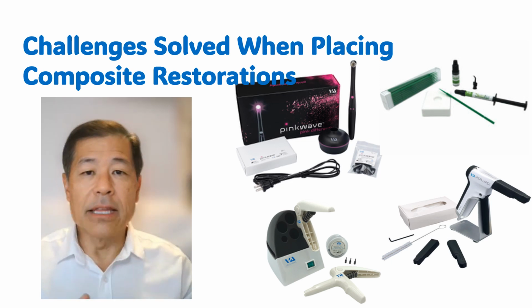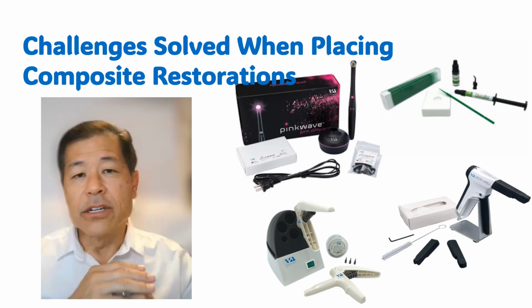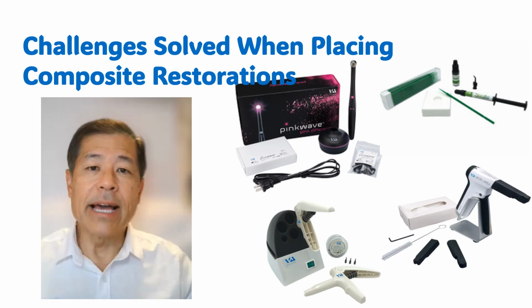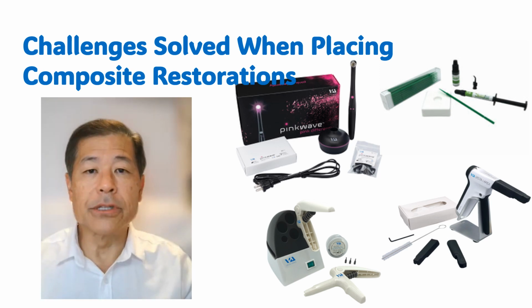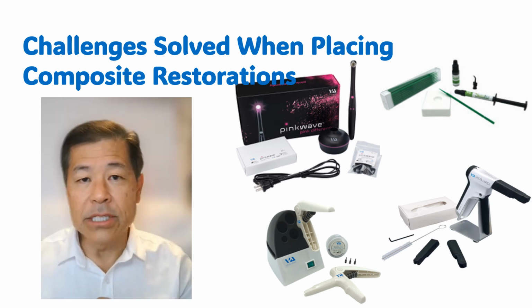Voco has a very highly filled composite, and when you squeeze that out of the composite dispensing gun, it's very thick, and to spread it is very difficult. But it has a lot of the great physical properties you want in a composite, but it has so much filler in it that it just makes it a little bit harder to handle. Some composites we use can be naturally sticky. Place those same composites in a composite warmer, and your handling gets so much easier.